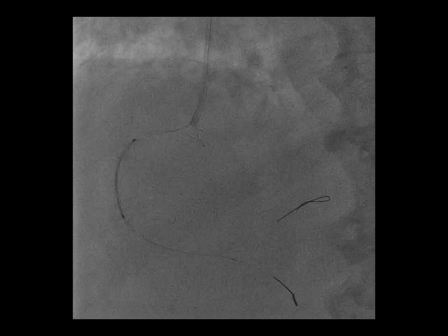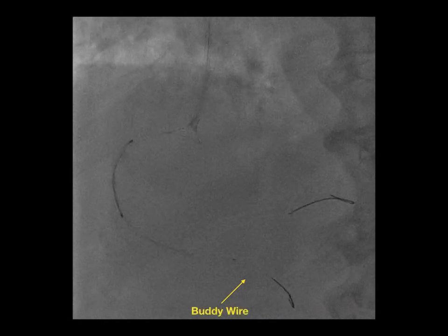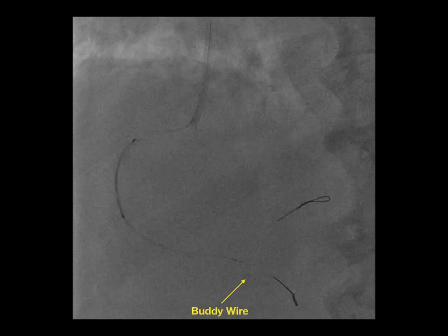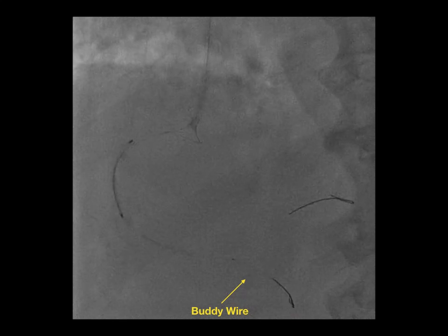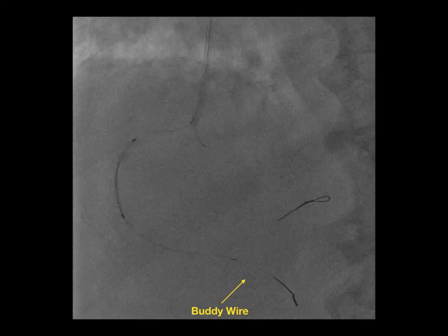We tried to deliver a stent across the lesion — we had the Syntes Alpine 2.75 x 33 — but as you can see, the stent didn't even cross the proximal site of the occlusion, despite what seemed to be adequate lesion preparation. We tried to place a buddy wire to help cross the occluded segment, placing a BMW wire in the posterior descending artery, but as you can see, this didn't help at all.